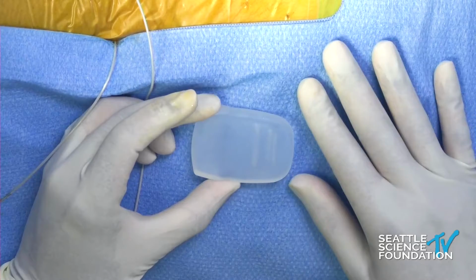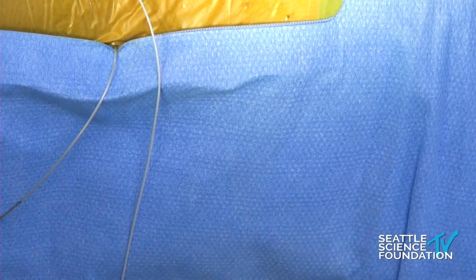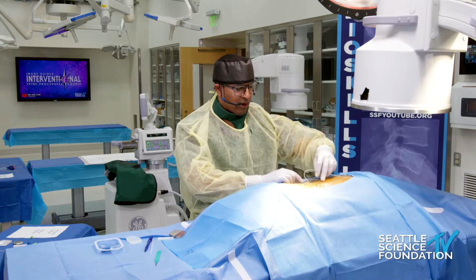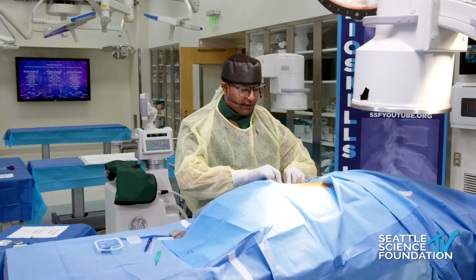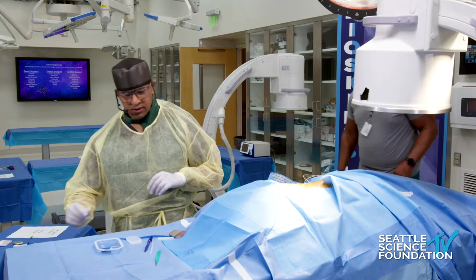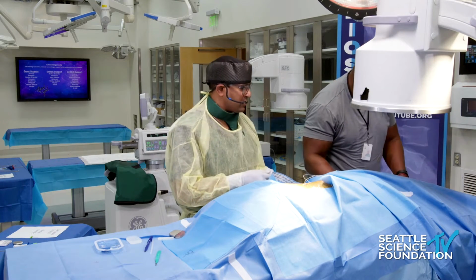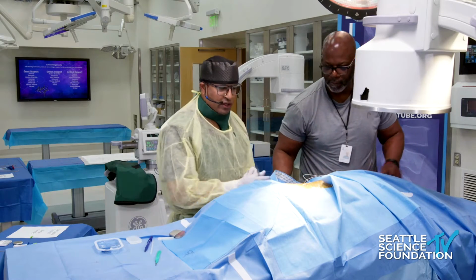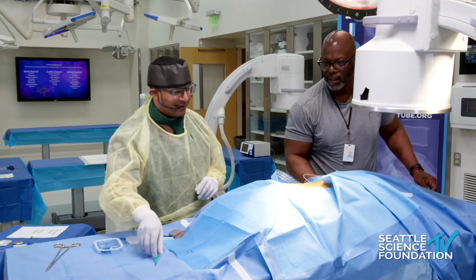So, for example, if we chose to be up more lateral here, the drapes are sort of limiting me, but I'll just arbitrarily go out this way and see if we can remove some of the drapes. Do we have any Metzenbaums or heavy scissors? And this is a needle driver. Okay, so we'll work with what we've got.